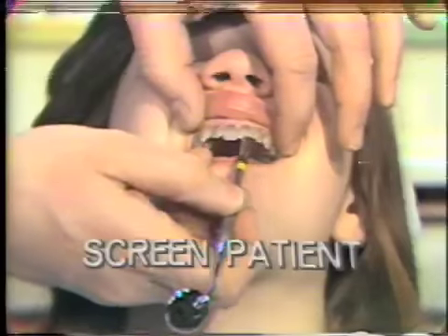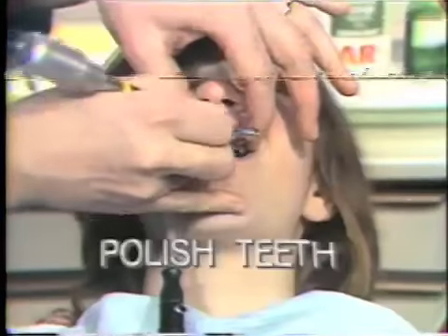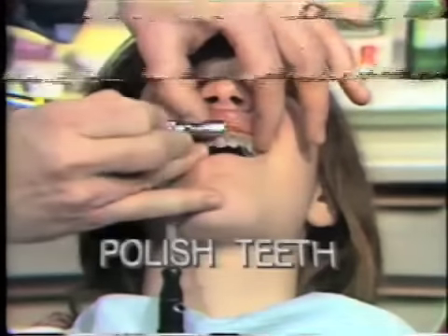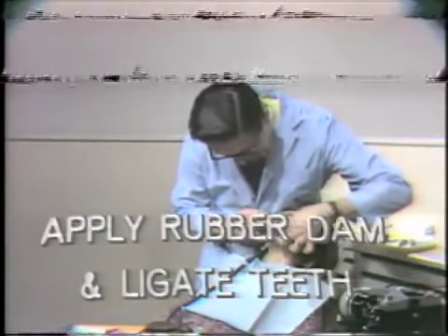I'd like to take and review the procedure very, very quickly of the bleaching technique. The first thing we'd like to do is to screen the patient. Take an oral exam, take a good look at those teeth, take an x-ray exam, view the periapical area very carefully, and do the electric pulp test to ensure vitality. Next, polish the teeth. When you're polishing the teeth, the purpose is to remove any debris the patient may have on those teeth when they come to the office. Next, do a correct application of the rubber dam and ligate the teeth properly.